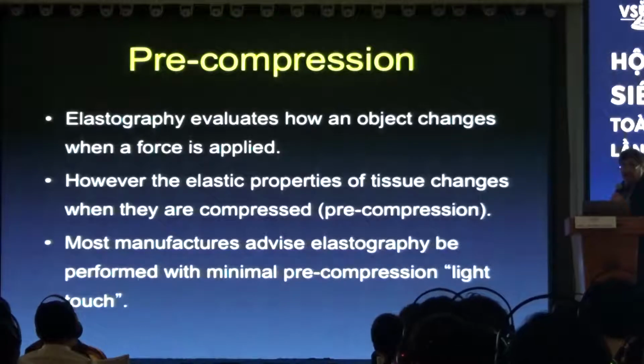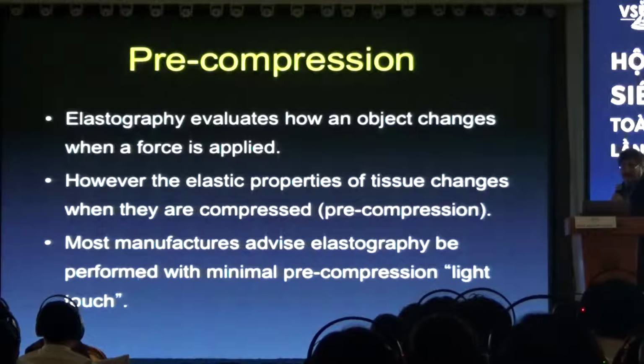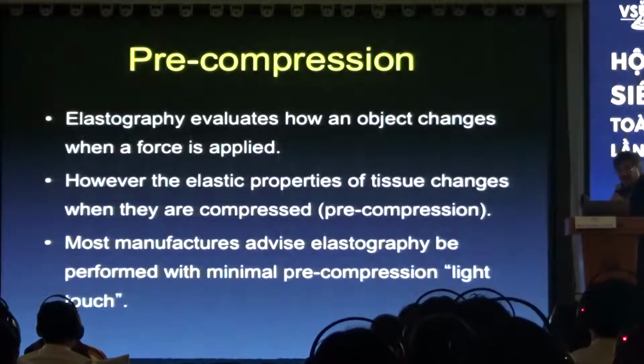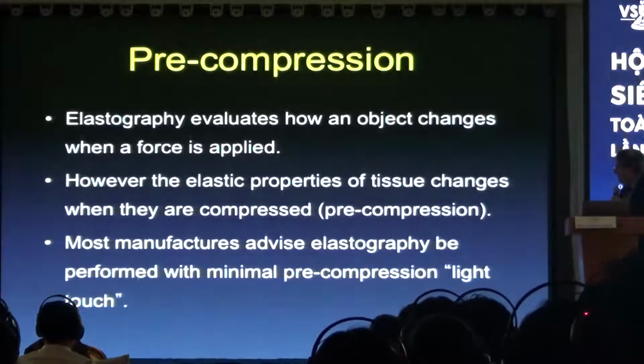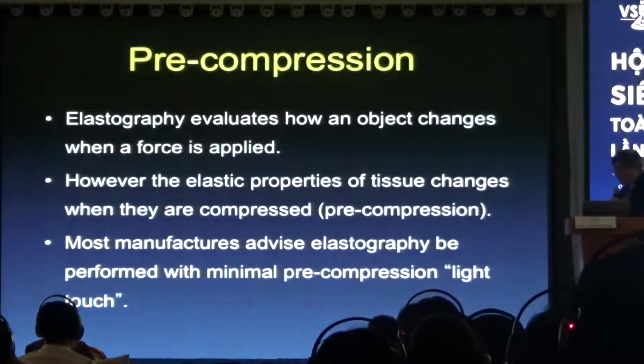And when you do that, you actually make lesions stiffer. So you have to do all these elastography techniques with a light touch or very, very little pressure. And again, I call this pre-compression, and you want to use this light touch.